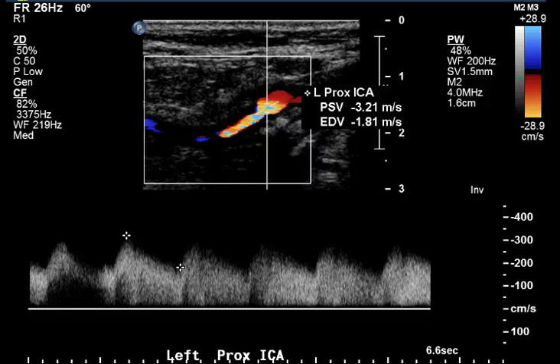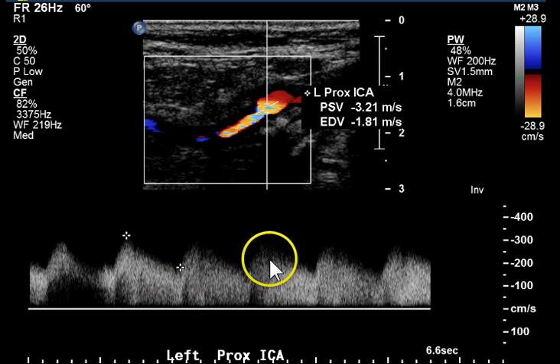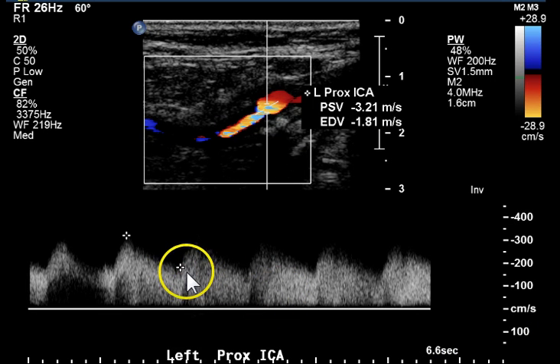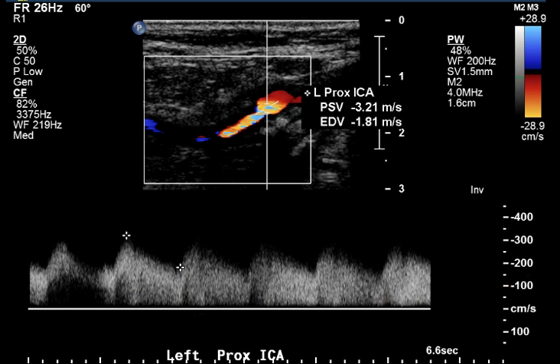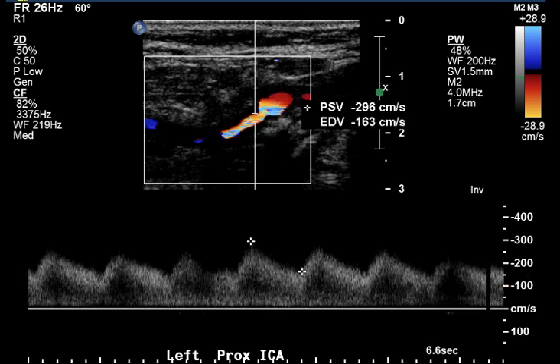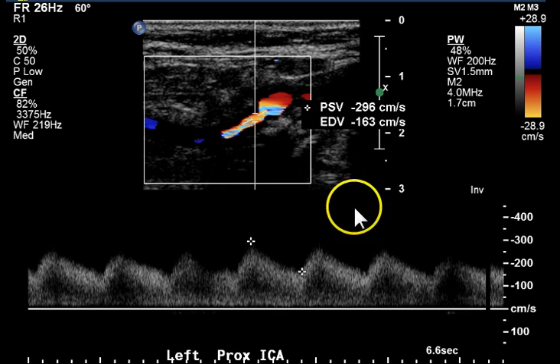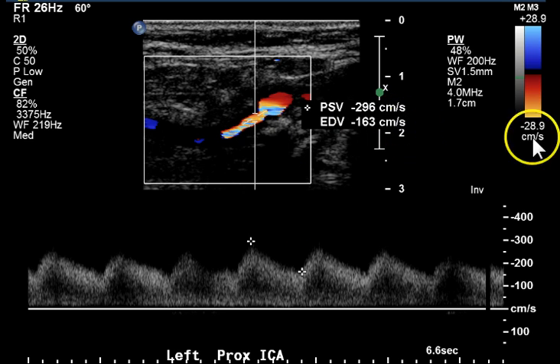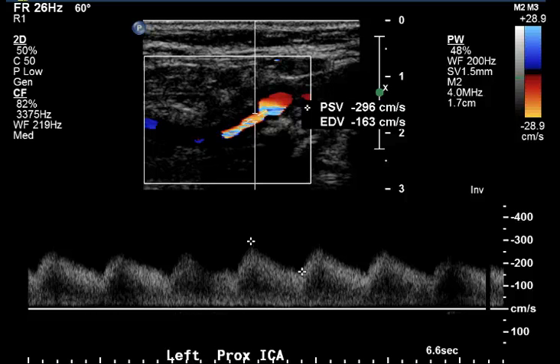The waveform of the proximal ICA is highly abnormal — it's a dampened pulsatility. Parvus Tardis is demonstrated with a very poor spectral window indicating turbulence. In an area of even further stenosis, we get a velocity of 296 cm per second and diastolic velocity of 163 cm per second. This corresponds to a disease level greater than 70% stenosis.